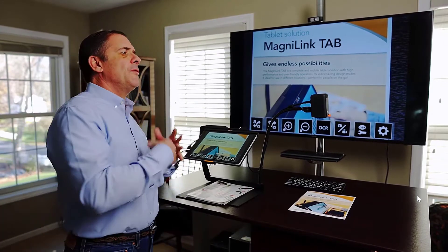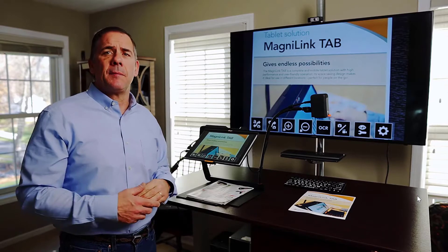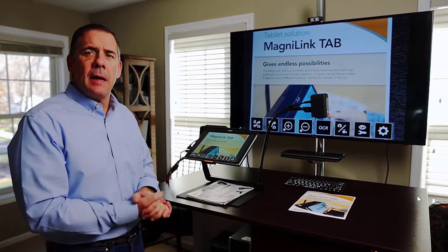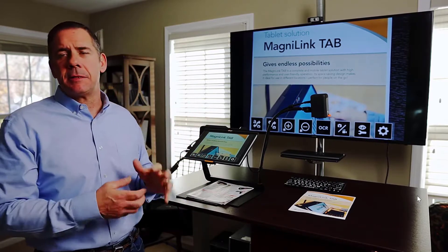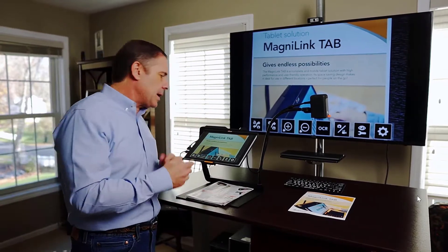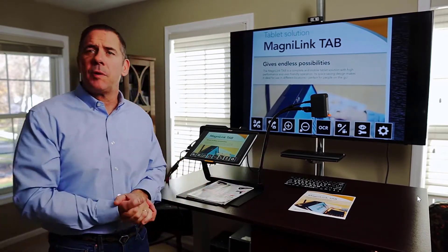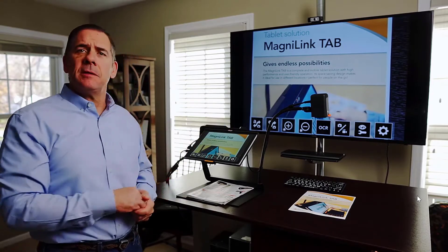I can then take that material, save it, read it at a later time, move it over to another software program like Word, manipulate it, edit it, and email it out. It has so many functions built in because this is a Windows operating system running behind this machine. It's gesture-based; we have a keyboard option — you can use a Bluetooth keyboard, or run it by the bar of buttons on the bottom.